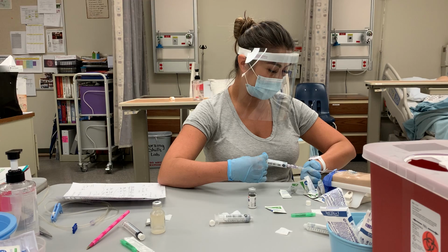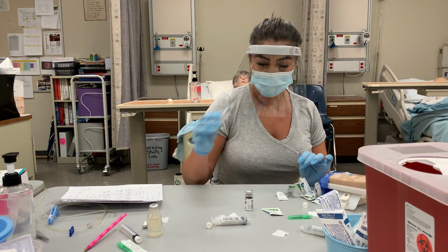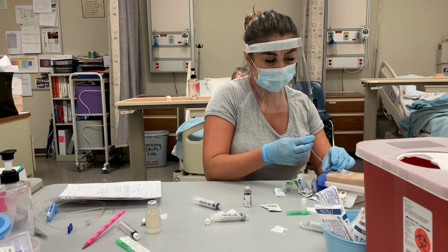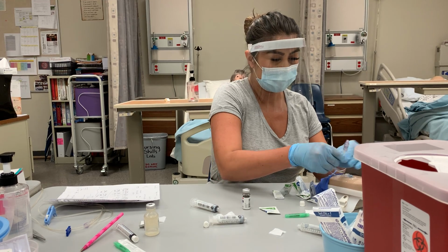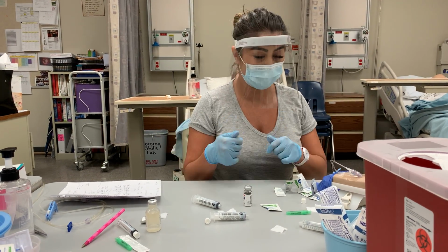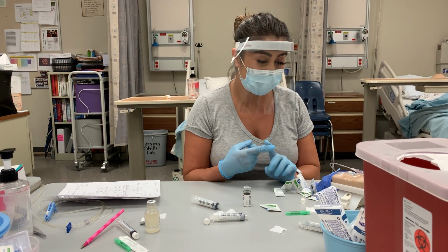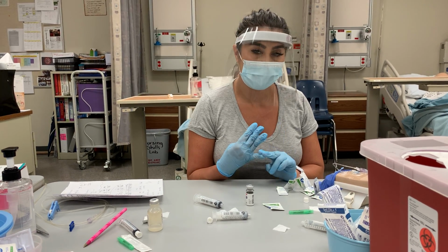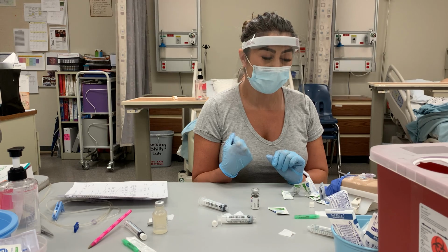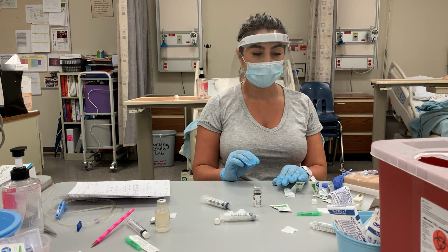Okay, so we're gonna push the last of it. Let me go ahead, this is on a saline lock, just clamp it, and then take this back to the patient. If they were on a pump, we would restart the pump and unclamp it. I would document the medicine I gave, how much, what time, how the patient tolerated it, and document all that in the computer, and then I would make sure I come back in 15 minutes to check on my patient.